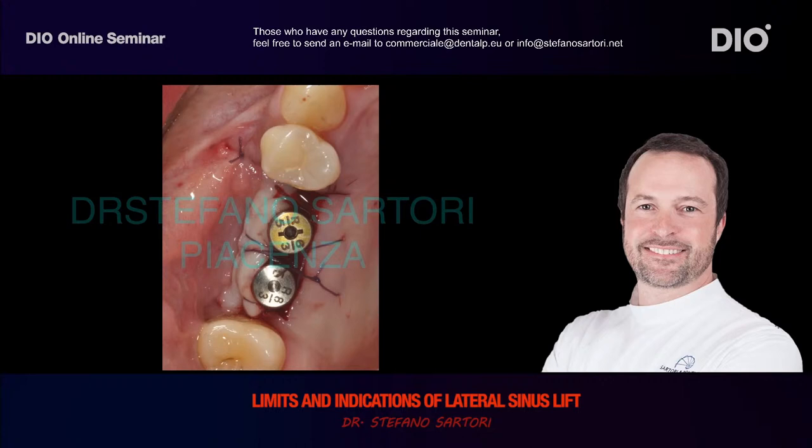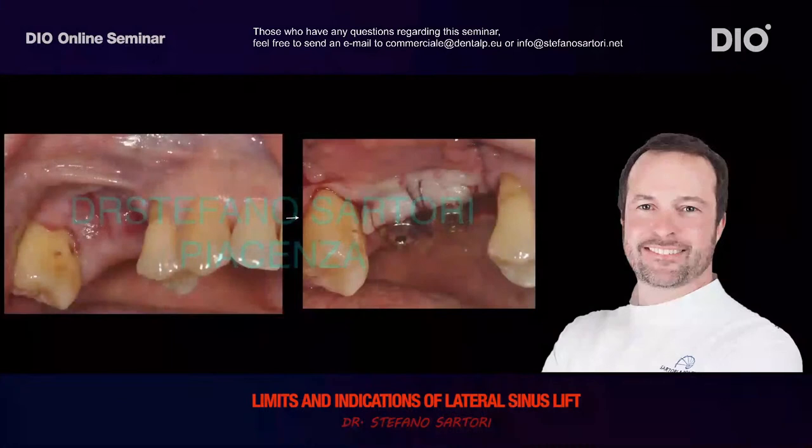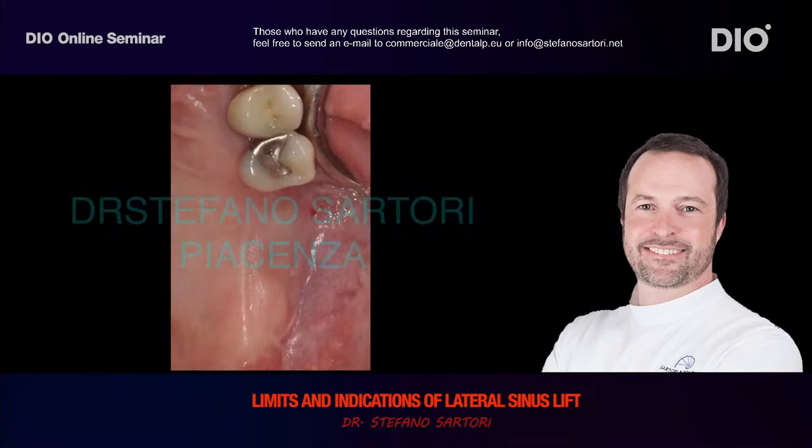In the next slide, I will compare the quality and quantity of soft tissues and the muscle insertion before and after soft tissue management. Look, before and after on the right. This is the left side. Same situation as the right side.